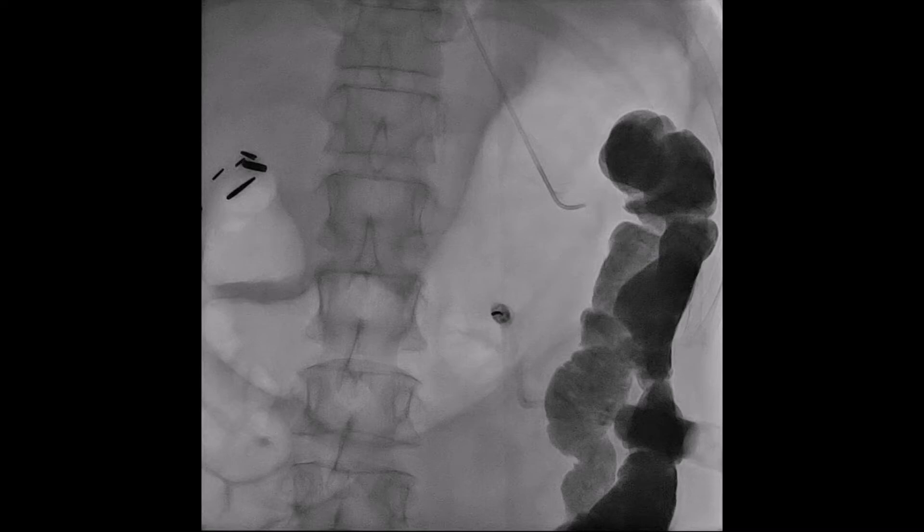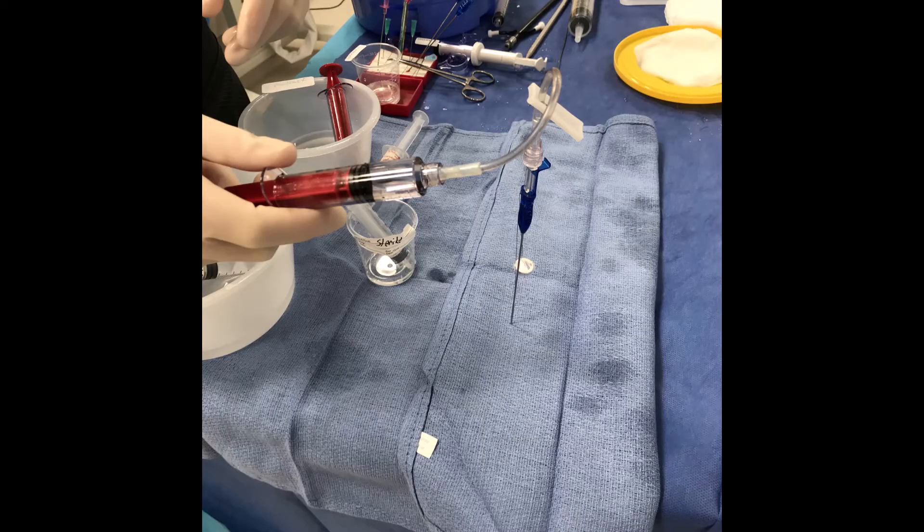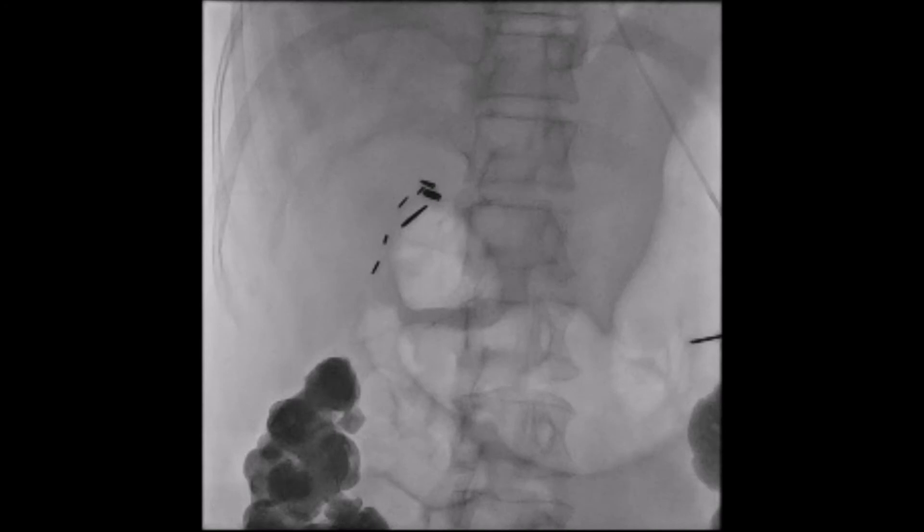This is a picture of me placing the first T-tack fastener. The needle is directed at the stomach with a barrel-on-end appearance, which helps confirm the needle is on target and headed directly for the stomach. The colon is clearly out of the path of the T-tack. The T-fastener is connected to a short piece of tubing hooked up to a half-filled syringe — this setup keeps my hands outside the field of view while I get the right trajectory before advancing the needle. I seat the needle in the AP projection but actually advance it into the stomach using an RAO projection. The syringe is half-filled with contrast, allowing me to aspirate air once I puncture the gastric wall.